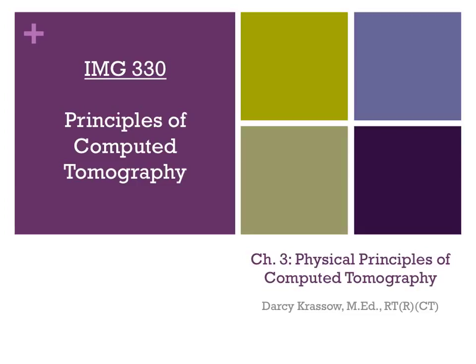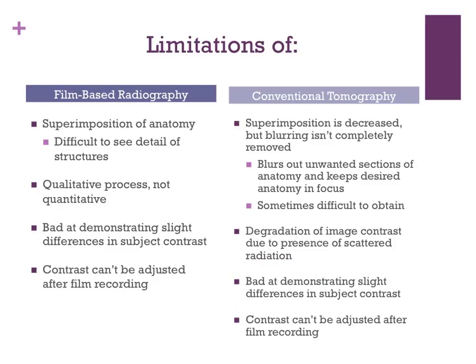Chapter 3, Physical Principles of CT. So real quick, we'll discuss some of the limitations of film-based radiography and conventional tomography.